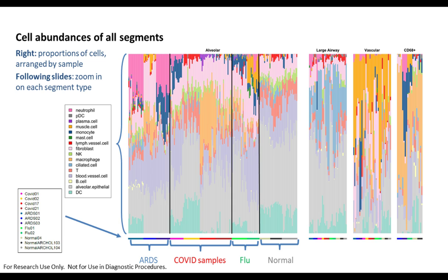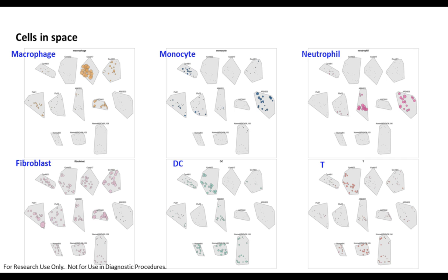Basically, this is early times, but we're really going to try to use this data to understand the different cell infiltrates that are being driven in the context of the disease process, and how this may ultimately be impacting the histology that we're seeing and also the downstream signaling. Now, this is looking more at the bulk analysis, but we can actually look within the specific sections themselves and see where the different cell types are being mapped spatially. And I think this is one of the real strengths of this platform.